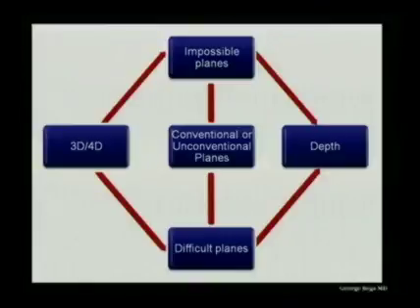So this would be a typical plane that is possible otherwise, but very difficult to get. Another unconventional plane is the secondary palate plane. Secondary palate typically is very difficult, and it needs depth. It needs depth that only a volume ultrasound acquisition can provide.